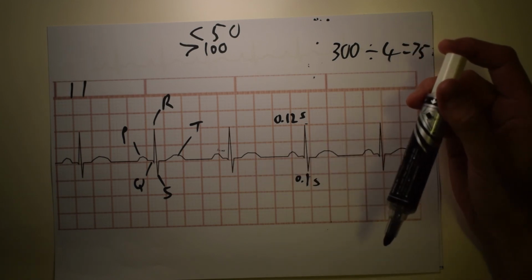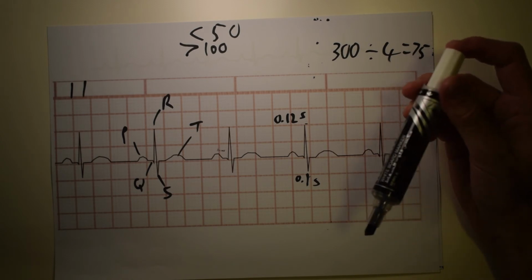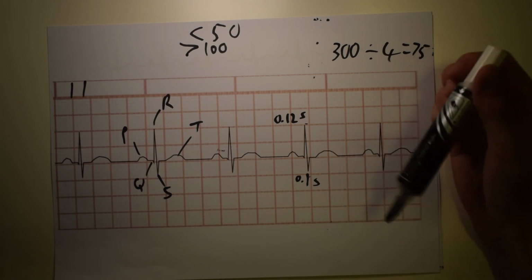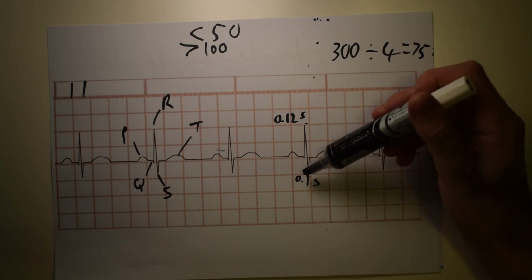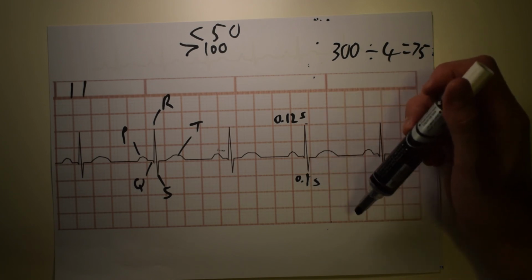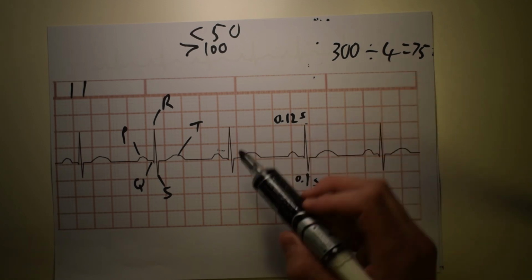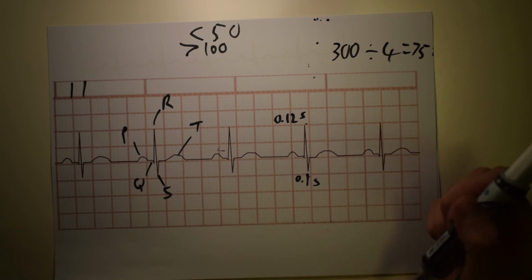That is going to help you work out whether you have a heart block, first degree, second degree, or third degree, which we'll discuss at a later stage. Questions like: how long is your QRS? Remember, it shouldn't be longer than 0.1 second. It can go up to 0.12 seconds. If it's longer than that, then you have a broadened QRS, and that's something also to take note of.